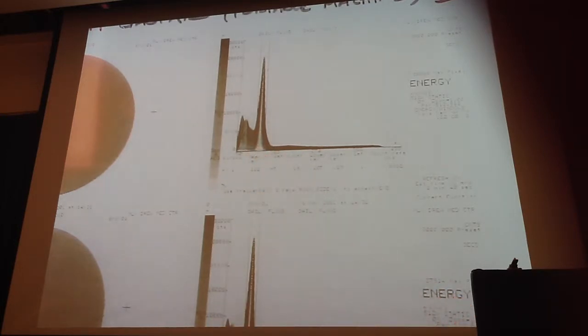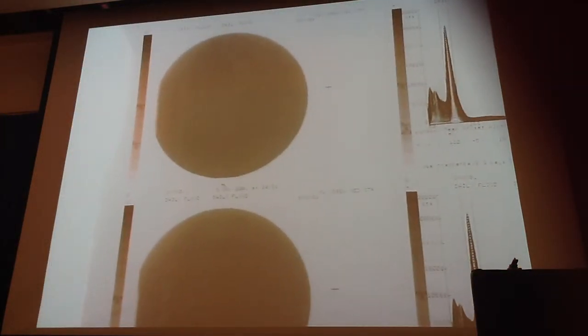Sometimes people do what they call an asymmetric peak. So in other words, they'll do this first, and then they'll acquire the flood, the uniformity flood, because that's your next thing. How many counts do you normally go for on your uniformity flood? 4 million? 5 million? 3 million?